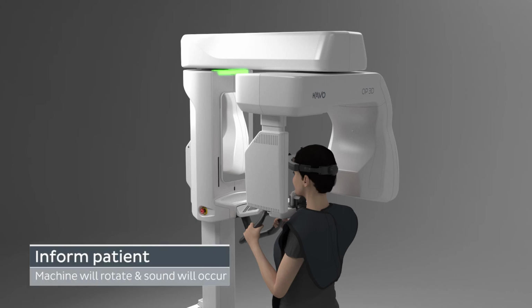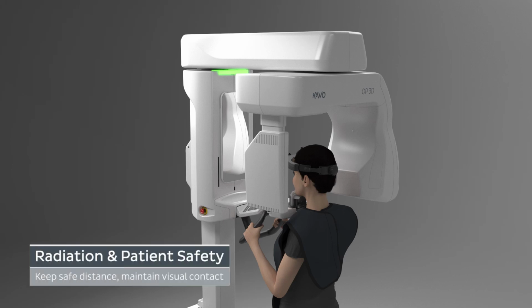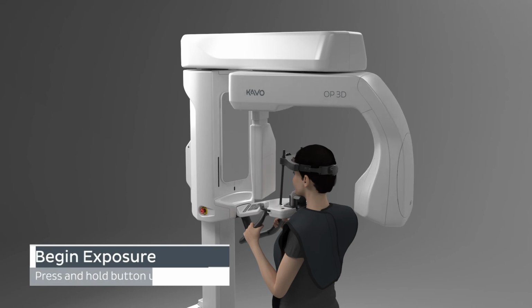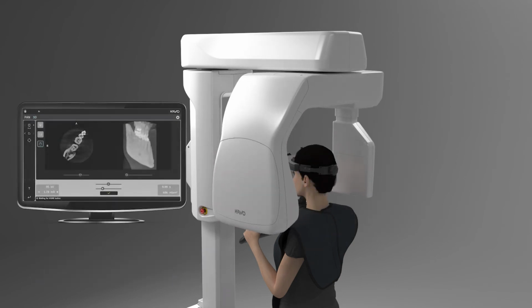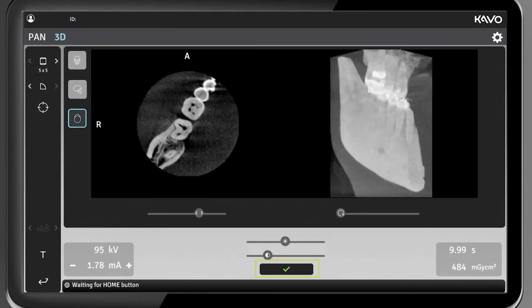Inform the patient that the machine will rotate around their head and an audible sound will occur. Protect yourself from radiation in accordance with local safety guidelines and regulations while maintaining visual contact with the patient during exposure. Press and hold down the exposure button until the process is complete. The patient can now be removed from the OP3D. Press the OK button to confirm image acquisition.